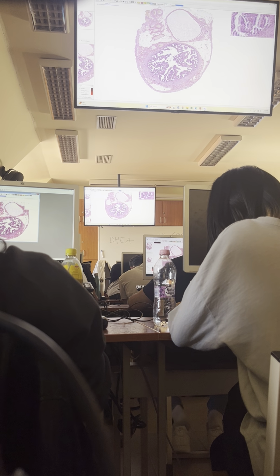I call your attention to the fact that the height of these two cell types are the same now in the estrogen phase. And I emphasize this because this will change in the progesterone phase. So that's one important thing on the basis of which you can recognize which phase the uterine tube is. Those are non-secretory cells, they are ciliated. The darker ones are not ciliated, but they secrete a mucoid substance.